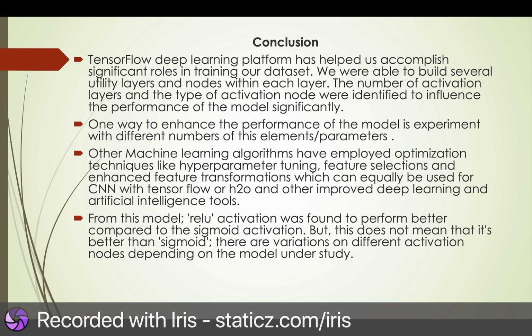The number of activation layers and the type of activation node were identified to influence the performance of the model significantly. So one way to enhance the performance of the model is to experiment with different numbers of these elements and parameters. And from my experience, the more the data, the better the outcome.